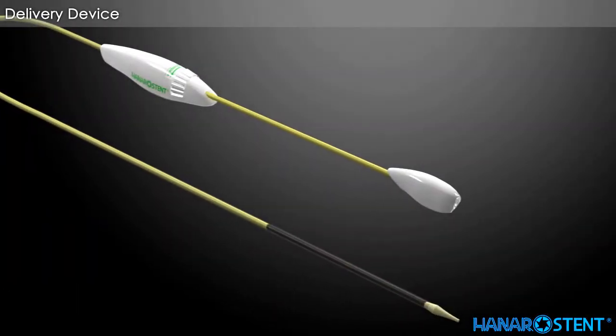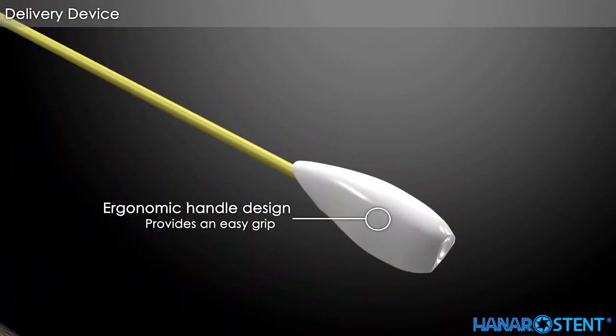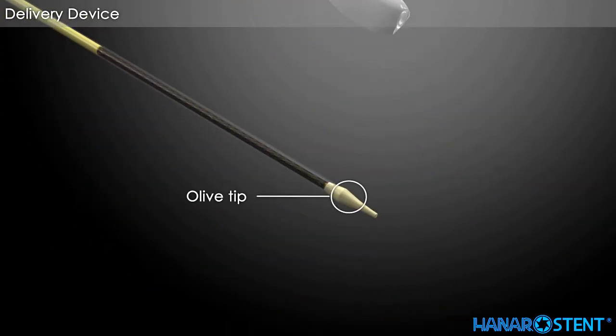This is a delivery device for the Hanaro stent esophageal valve stent. The locking system prevents accidental deployment during placement. Flexible olive tip.